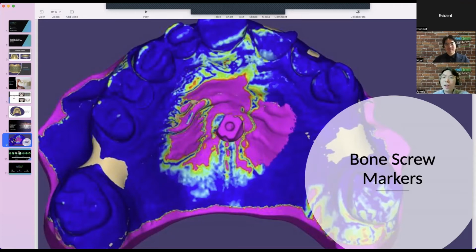Yeah, so it really depends on your in-house setup, and also on the perspective of immediate loading. Let's say you have all those materials and equipped units, then you can go ahead and 3D print, and you can even use a stain kit and polishing kit. For polishing, it really has to be great because, for hygiene purposes, it has to be nice and smooth. For that purpose, you can get a lathe and pumice. You can set it all up just like a lab.